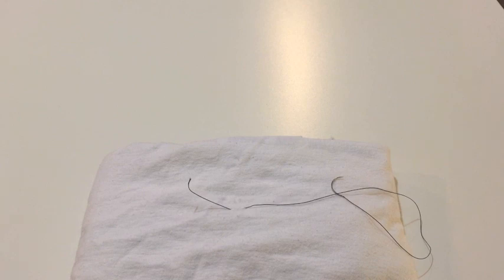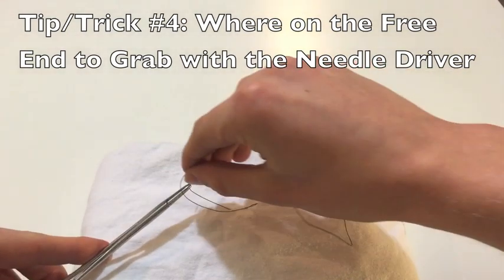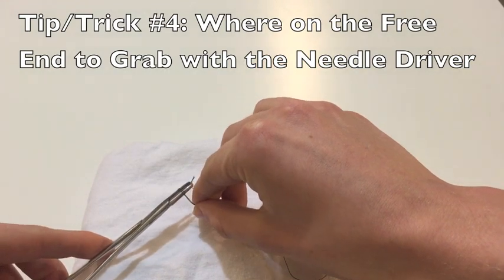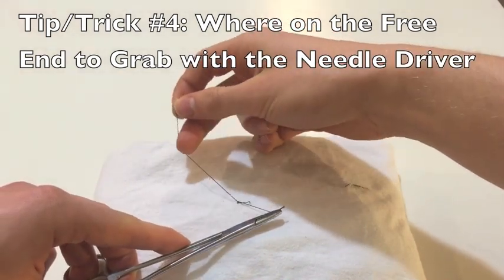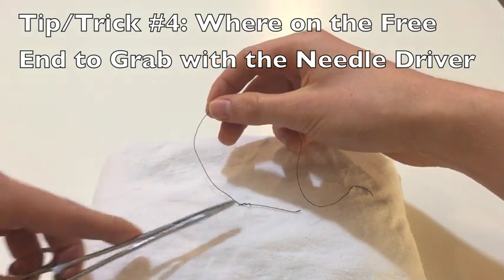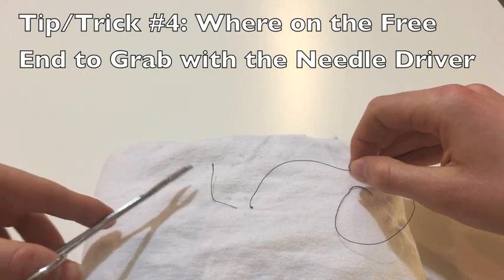My fourth tip is going to be where on the free end to grab with the needle driver after wrapping your suture. Using the same tips from the last trick — here I'm going to make sure that I grab at the end of that free end. That way, when I pass my knot down, you can see that everything is laid down very nicely. I'll show you what happens if you grab in the middle or at the base of the free end and how it just doesn't lay down as well.